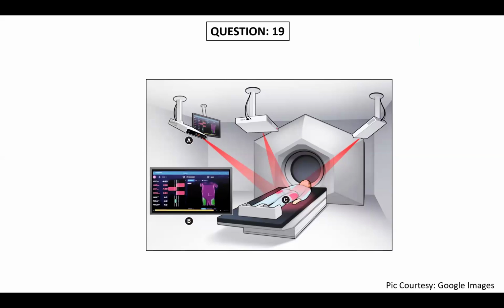Don't know, sir. Cost. No, not only cost. You cannot say cost. Cost is always a disadvantage. Time, sir. More time the patient will be there. No. The main thing is, you are seeing the external breathing now. We don't know about internal. Internal organ movements are also there. It's only the external surface you are matching, trying to keep it. But we don't know what is that.